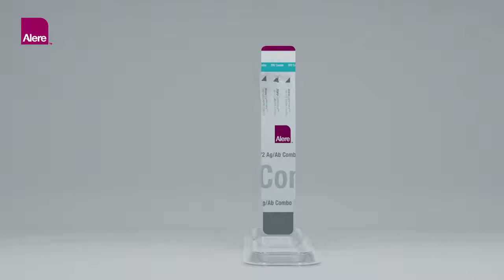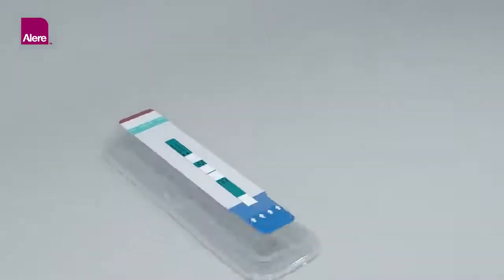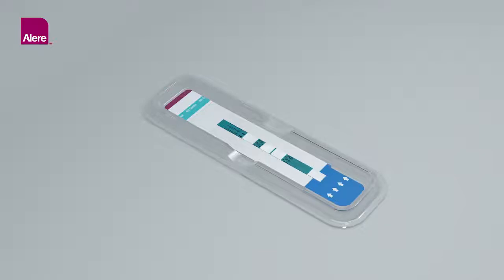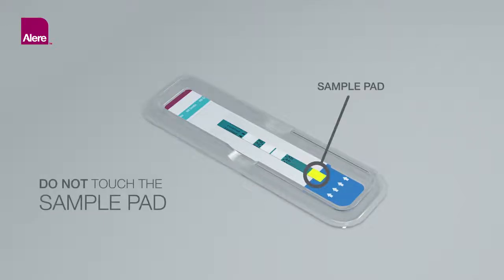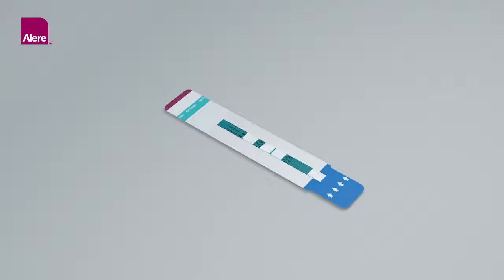Remove the protective foil cover from each test unit and lay the test unit flat in the workstation. The test should be initiated within 2 hours after removing the protective foil cover. Do not touch the sample pad with your fingers. Use of the workstation is optional; if not used, place the test unit on a flat surface.